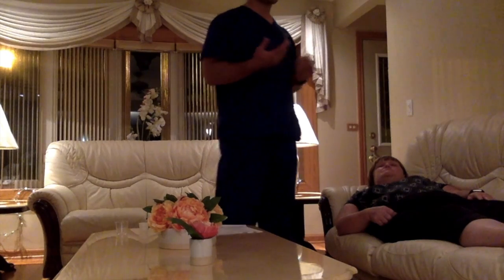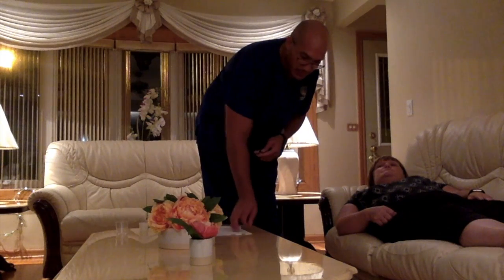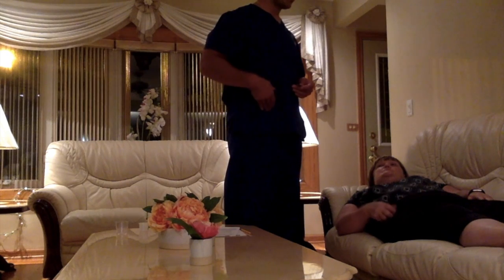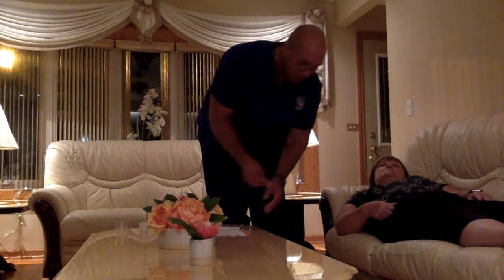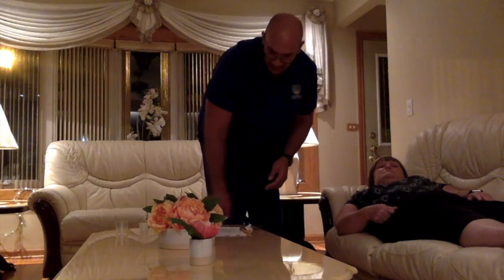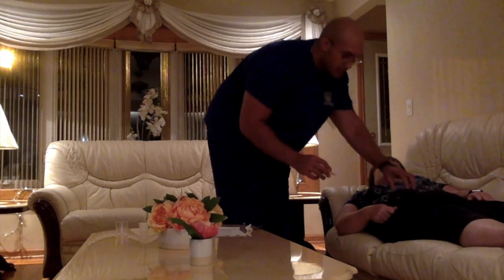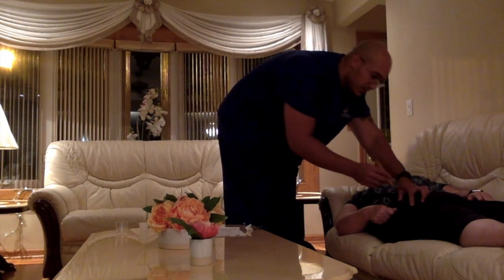Now, I have my gloves on. I completed hand hygiene. I have the medication next to the bedside table. I explained to the patient that I will be giving a subcutaneous shot into your right lower abdomen. So first, after I assess the skin, I'm going to clean the area with an alcohol swab. And then after I've cleaned the area, I have the syringe next to me, in which I will take the cap off, and then I'm going to pinch the area that I'm going to be giving the medication in. I will be going in at a 90-degree angle.